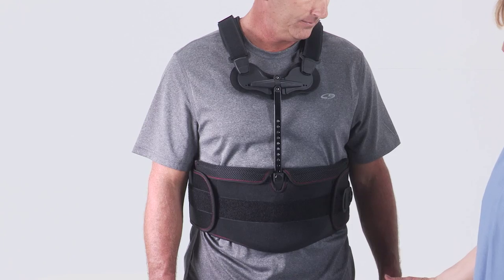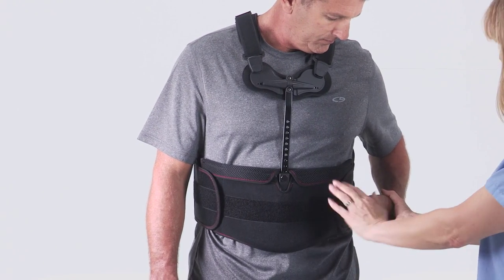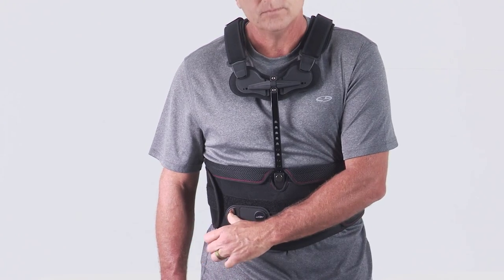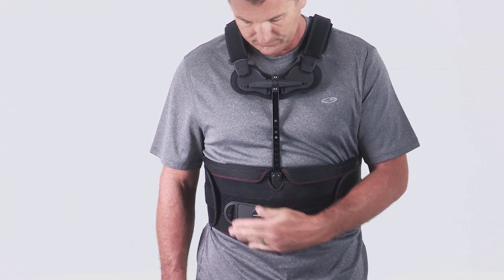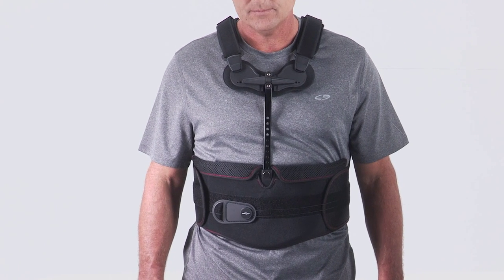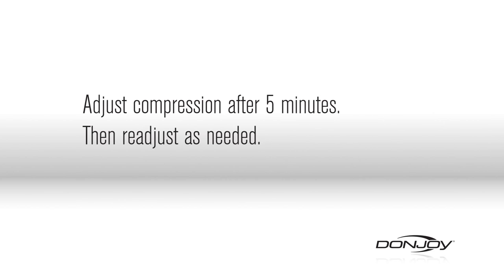To activate compression, have the patient grasp the pull handle and pull straight out from the torso. After the desired level of compression has been achieved, fasten the pull handle to the front portion of the compression panels. Adjust compression after 5 minutes, then readjust as needed.